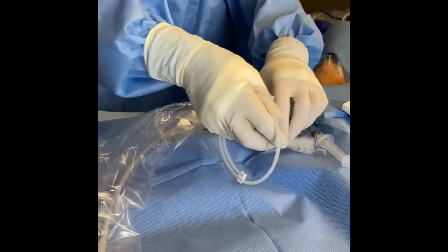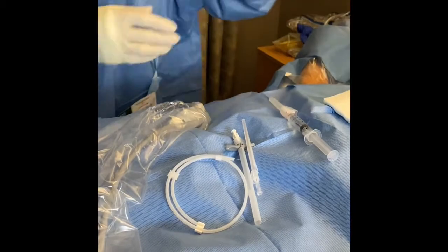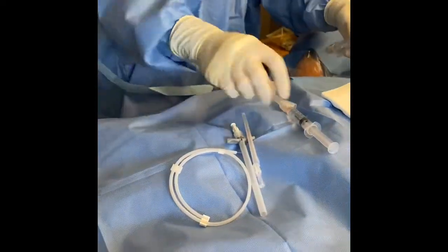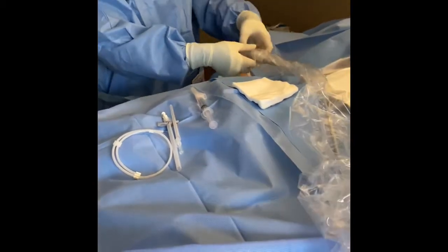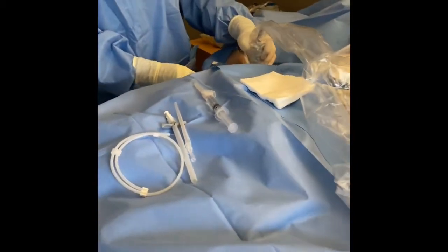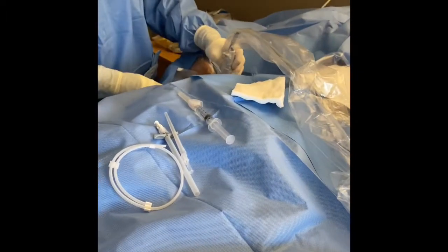So again, my trainee is doing a midline on a patient. If you do a midline, you don't necessarily need an x-ray after the procedure because usually the tip of the midline is only located at the axillary vein.